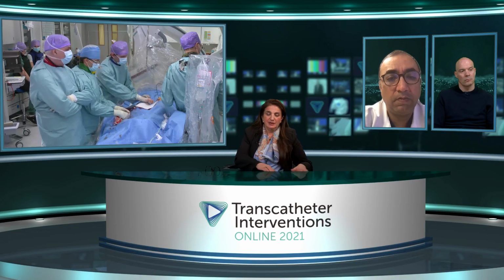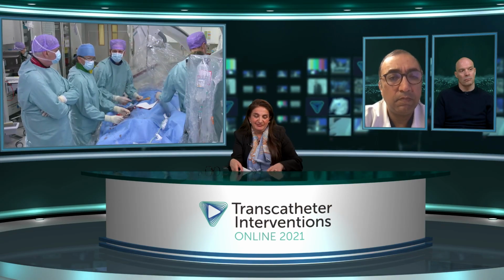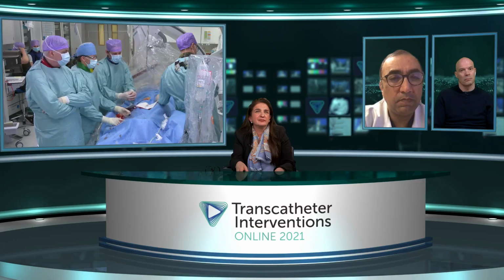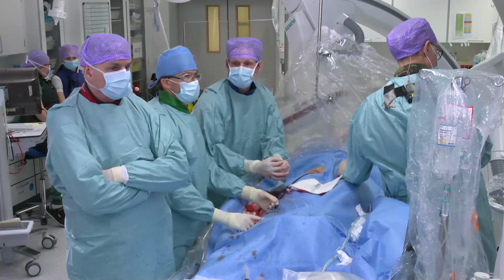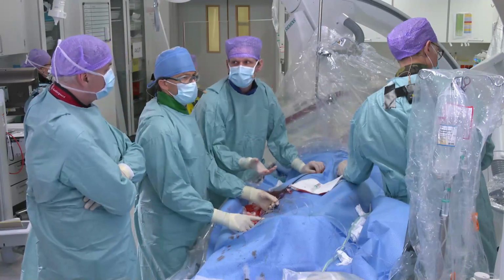We have done some control CTs even a week after and then 3 months after. What we see is, even very quickly, a week after, that even if you have very elliptical LAAs, they become immediately circular with almost all devices. But you still see the compression. It's not that you lose your compression.